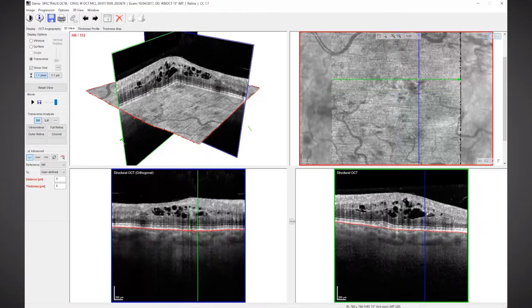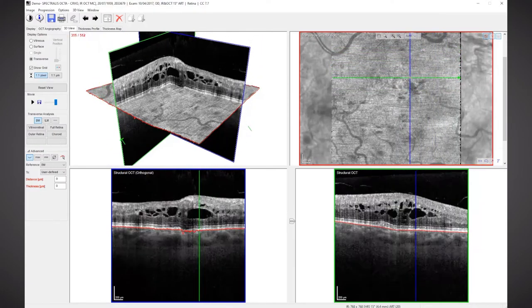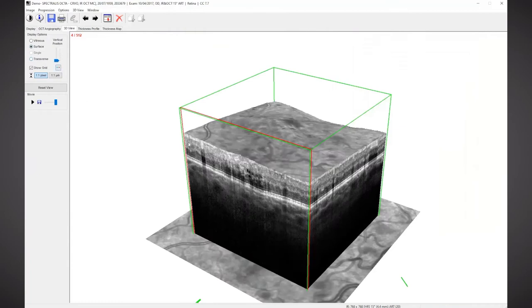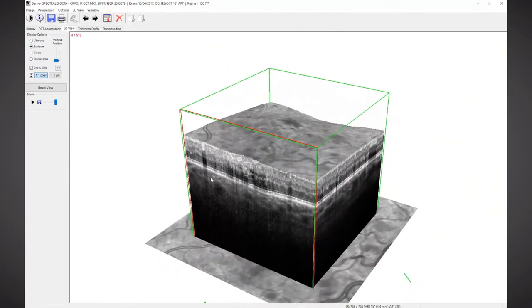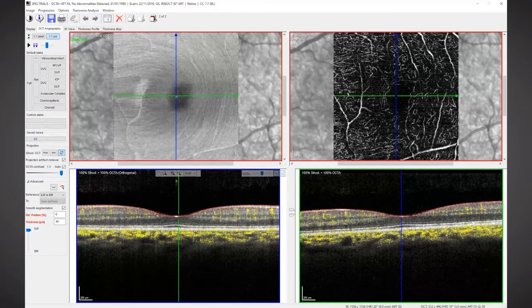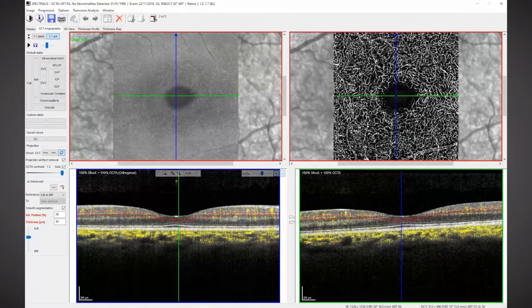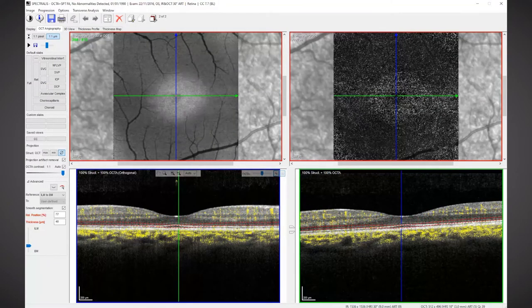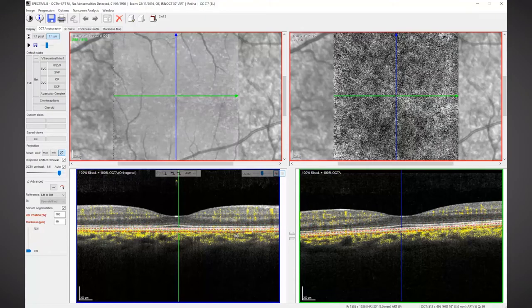It's important to understand that this is a three-dimensional data set — it's not like an FA, which is a two-dimensional imaging mode. There are some key technical components necessary in order to obtain reliable and reproducible OCT angiography information. You need the resolution within your OCTA to be able to monitor correctly the amount of flow through the capillaries.